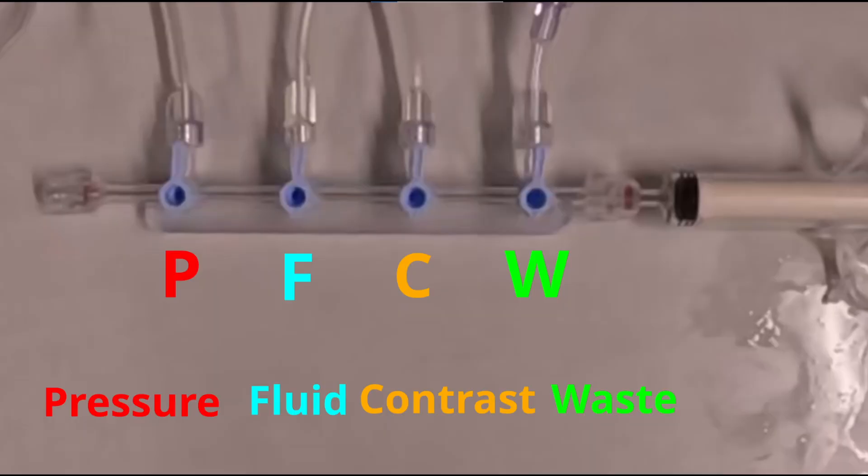This is the standard configuration for a four-port manifold. The first port is pressure, the second port fluid, the third port contrast, and the fourth port waste.